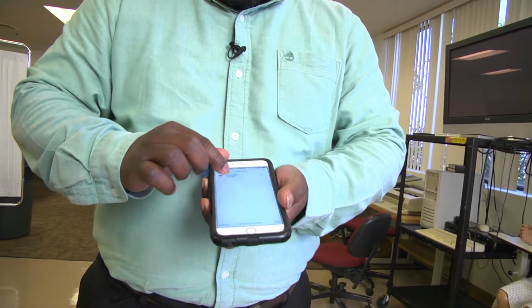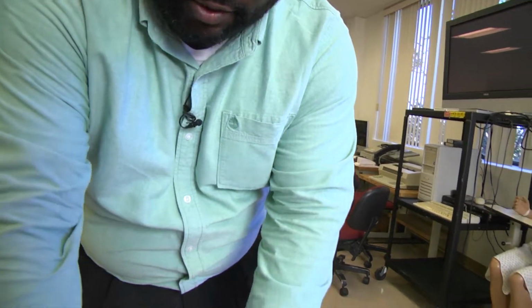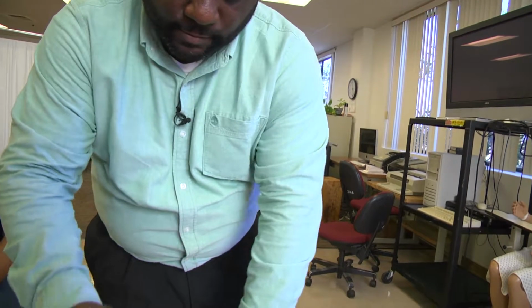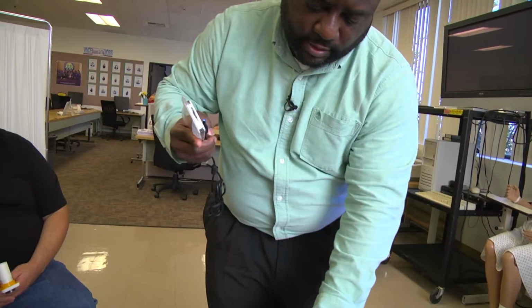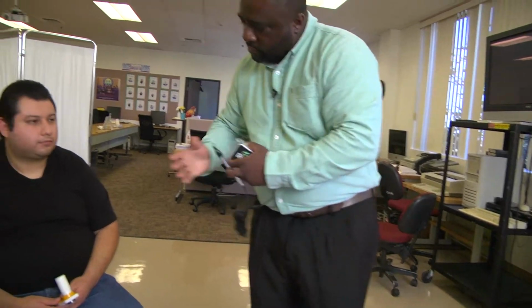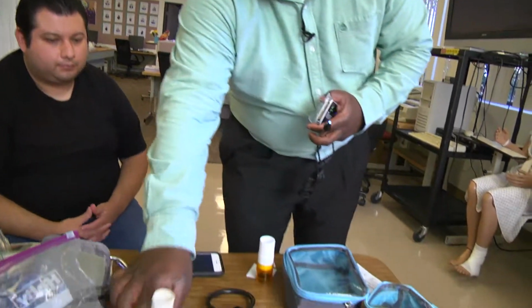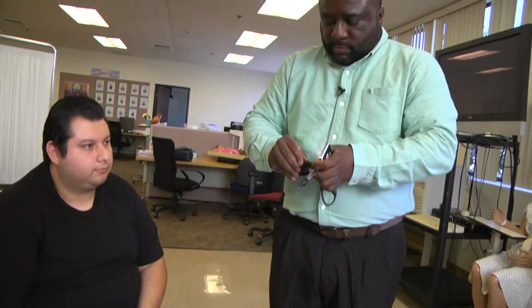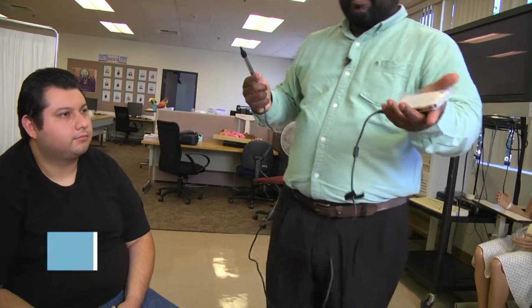So here's the camera application. So now you can see. Can you come a little closer about this one? This is the electronic box, and this is the camera. So the electronic box can be in my pocket.